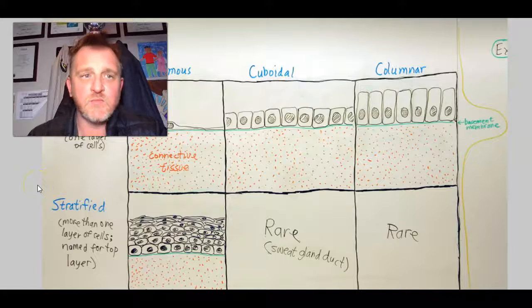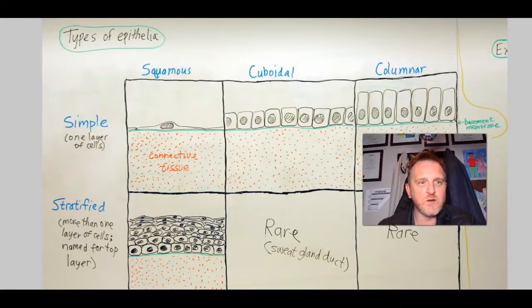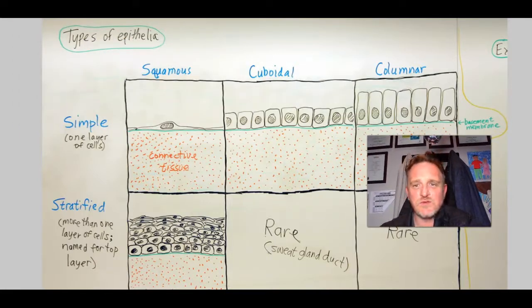If you can't learn it in 10 minutes, I don't think it's worth learning, guys. So we don't want to belabor the point here. We don't want to make this too long. We also don't want to make histology something that's completely abstract and challenging to learn.